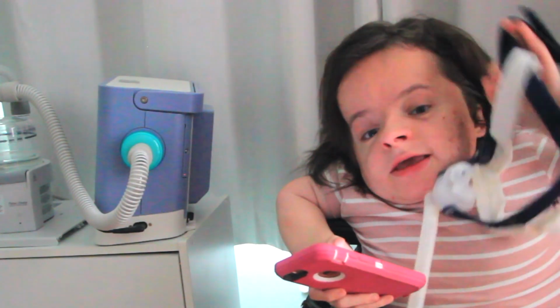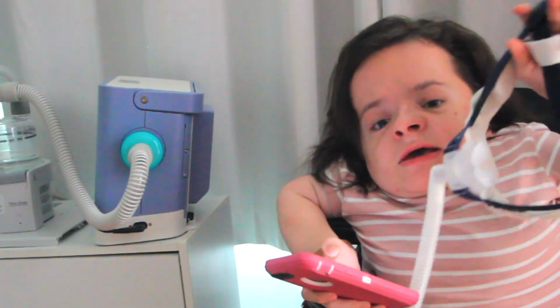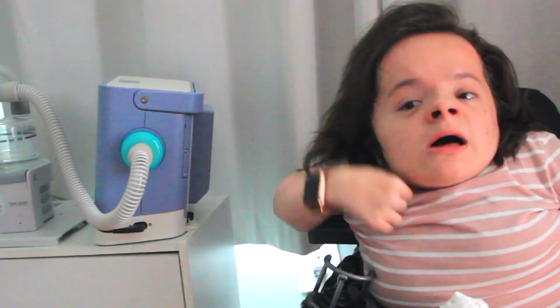You just gotta wear one of these gizmos. There's many different face masks and styles and whatever you feel is most comfortable. Now I will tell you, again, I'm not a doctor, so I'm not here to give you medical advice. I'm just saying what I've heard or been told. For people that have it and refuse to wear one, there's a lot of risk. It's not good to not breathe at night or breathe properly. It can cause all different things. Sleep is essential. Your body has to sleep. When you don't get good sleep, that reflects a lot on your health. It can cause high blood pressure. It can cause fatigue. All these different things.